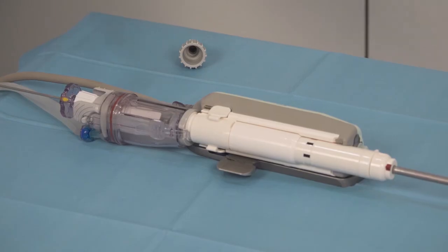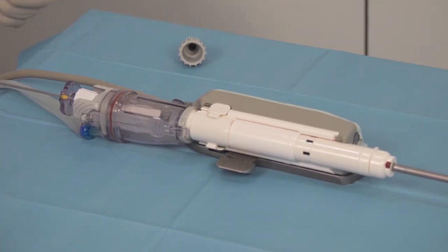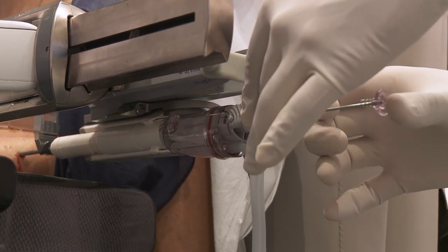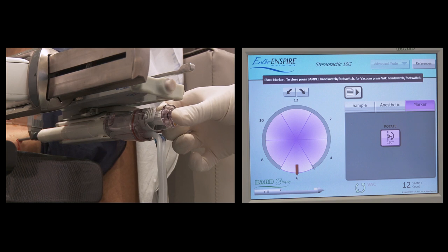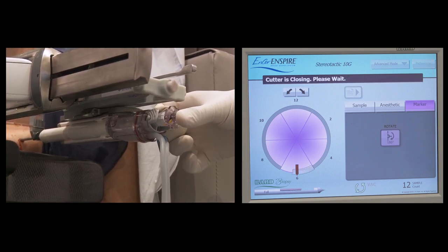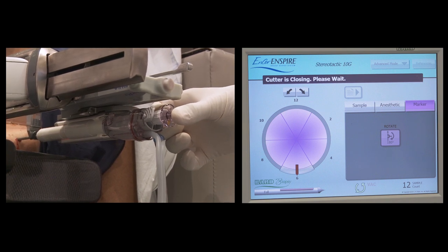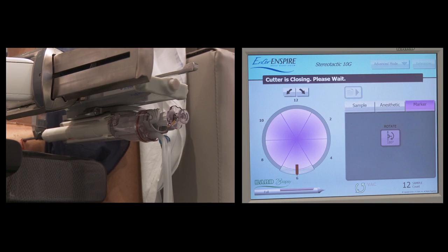Make sure the applicator yellow marker aligns with the red probe marker. Push the applicator firmly all the way to release and deploy the tissue marker in place. Touch the rotate button on the screen. The notch will rotate 180 degrees to avoid pinching the tissue marker while closing the notch.